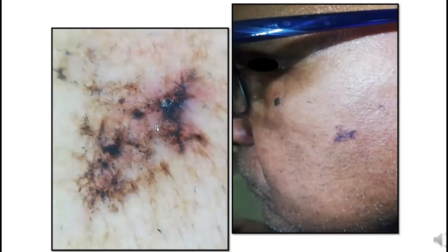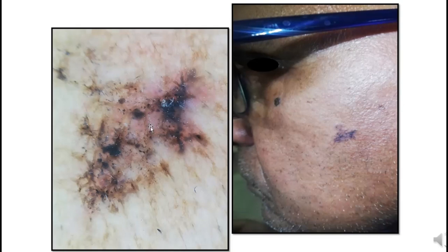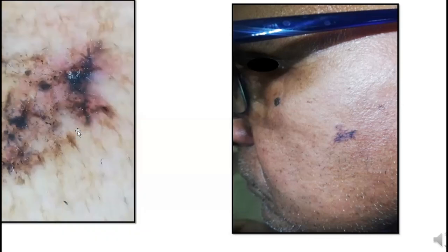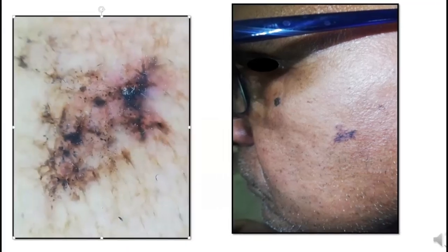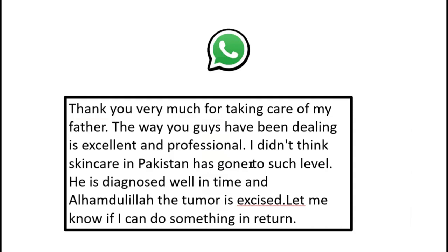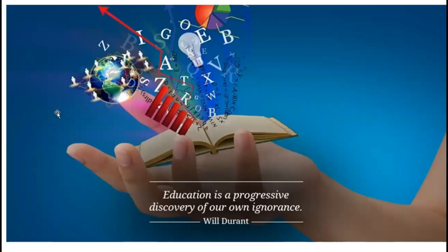On dermoscopy, we saw the pigmented streaks — two streaks coming from the same point, making up radial streaks, a maple leaf pattern, or spoke wheel pattern. We also saw isolated blue dots and globules. All these features combined were pointing towards a diagnosis of pigmented BCC. We sent the patient for biopsy and it came back as pigmented BCC. The message was gratitude from the son that his father was diagnosed in time and the tumor was removed.